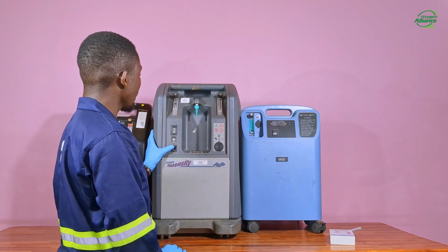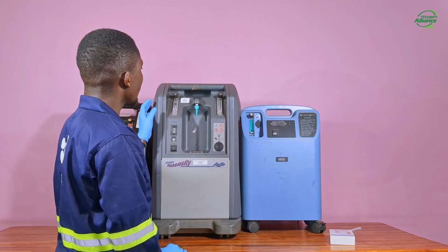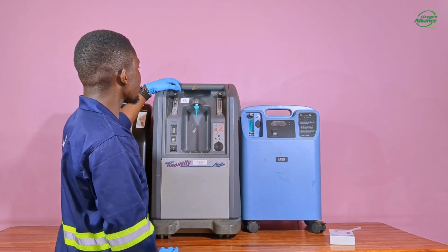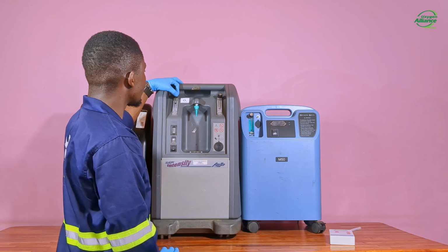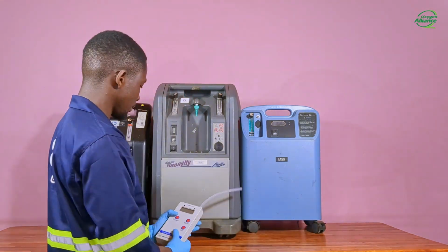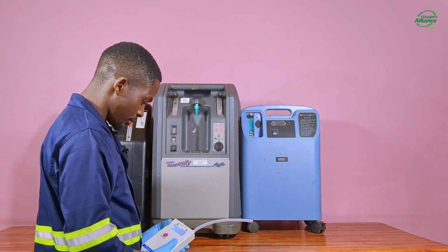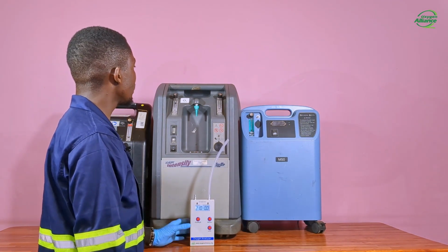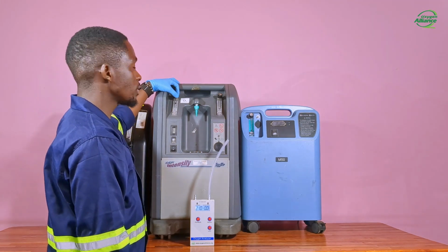Then we turn it on again and make sure you set your flow rate to the max. You wait for a few minutes for the concentrator to stabilize.